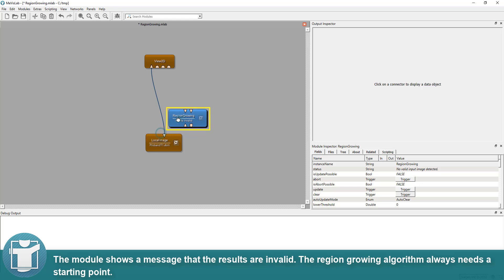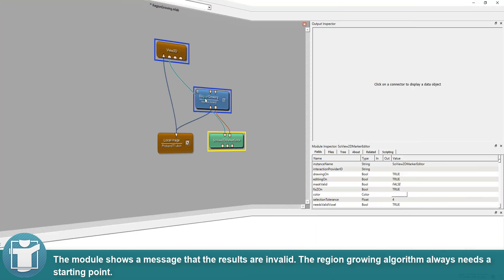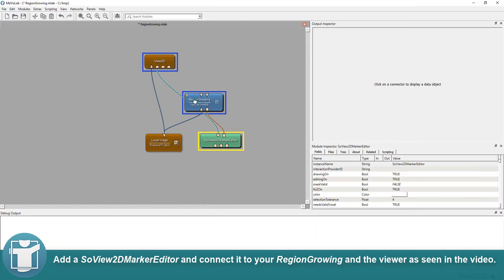The module shows a message that the results are invalid. The region-growing algorithm always needs a starting point. Add a SoView2D marker editor and connect it to your region-growing and the viewer as seen in the video.